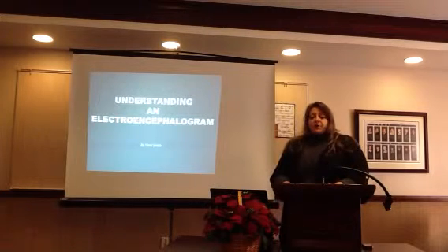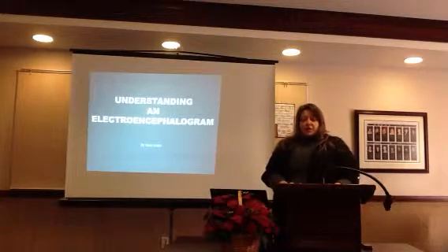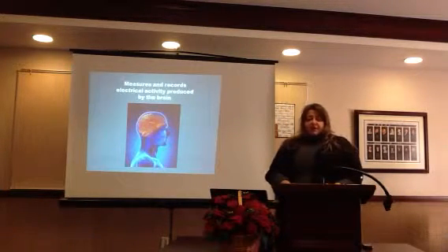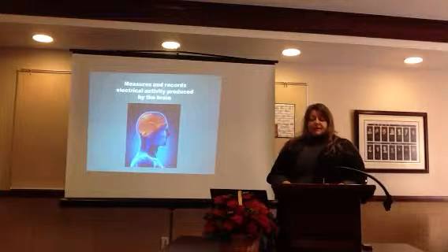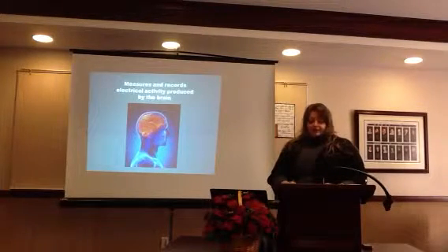Have you or someone you know ever had an electroencephalogram? If not, chances are you don't know what one is. An electroencephalogram, or an EEG, is a test that measures and records electrical activity produced by the brain.